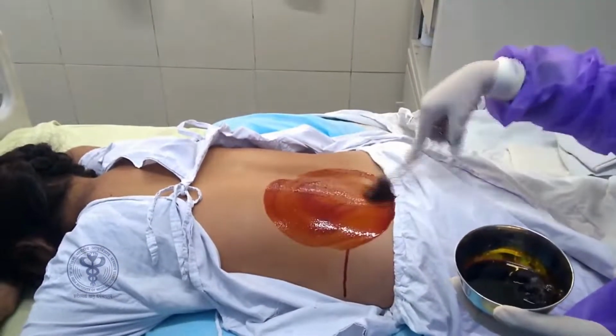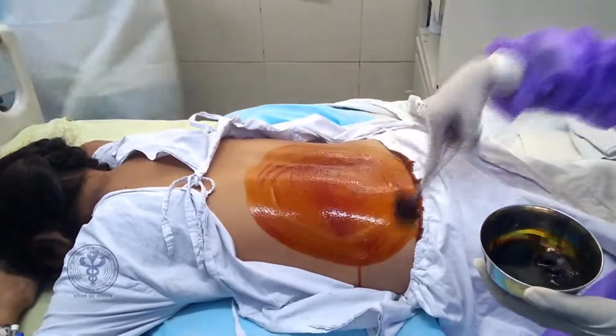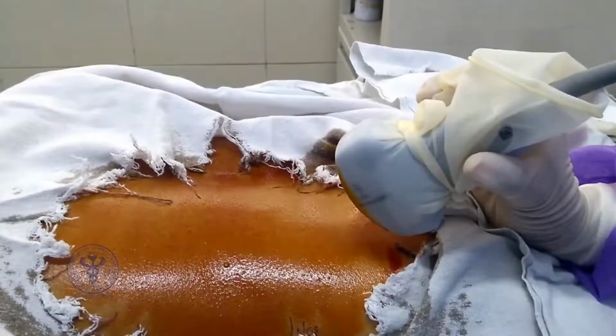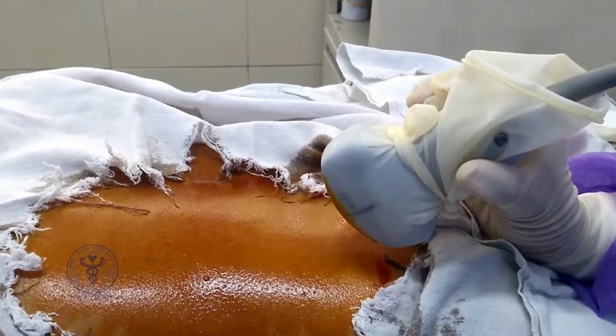Now use povidone iodine soaked cotton wiping in an outward spiral to disinfect the area. Put on the hole towel over the marked site. Ensure that the ultrasound probe is covered in a sterile manner.